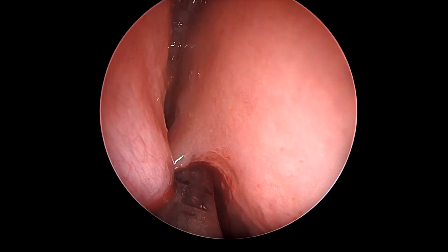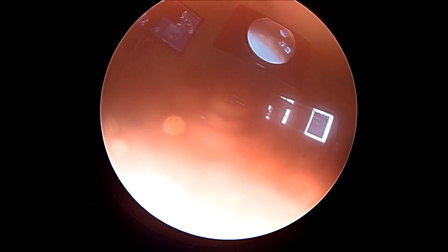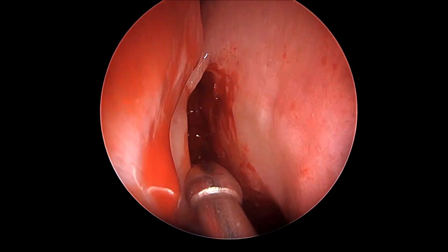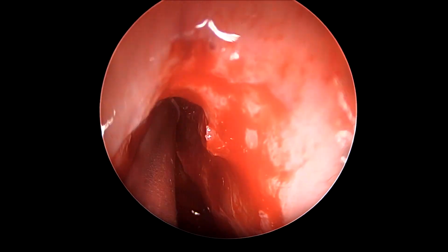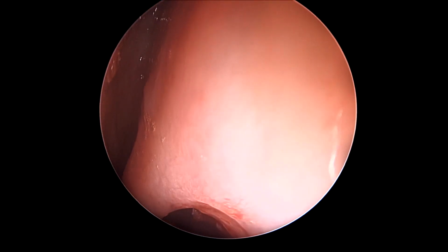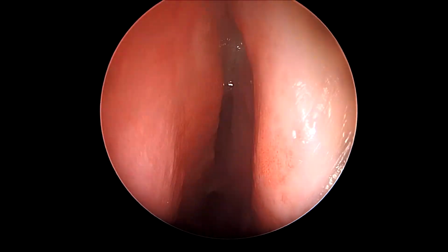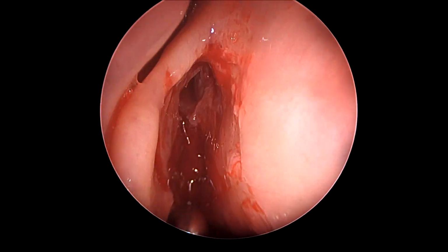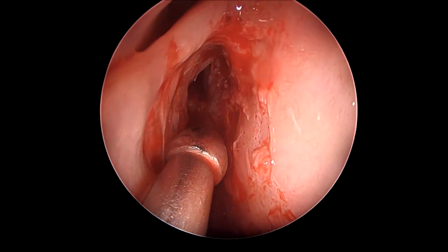One must be cautious in using this instrument because it often slips. So having a good engagement of the frontal beak region is very important while using the articulated punch, or so-called cobra punch, to be able to clear the bone. Otherwise, it just tends to slip and not cut through any bone. So as we clear, now we are able to see the view of the frontal beak, which is a very important landmark.